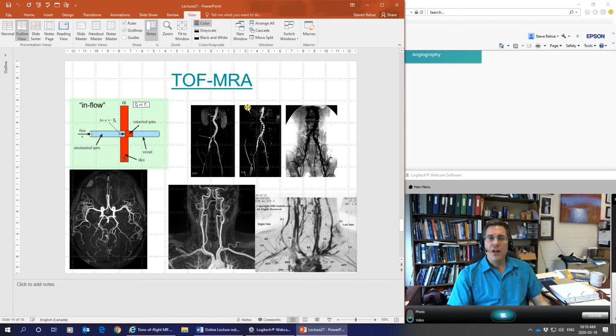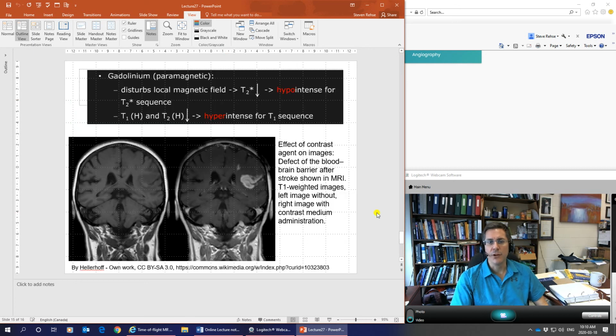So this is a way that blood can be used for contrast by making it a hyperintense or hypointense signal. And we talked about another thing in the multiple choice question we had at the beginning, which was injecting a magnetic material into the body. Just like blood can make the signal bright or hyperintense or dark hypointense, gadolinium can make the image bright hyperintense or dark hypointense. That's what makes MR so complicated. You can't just memorize things. You need to think, oh, what would it do?